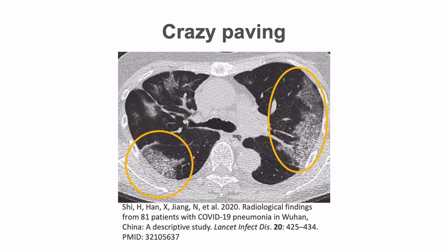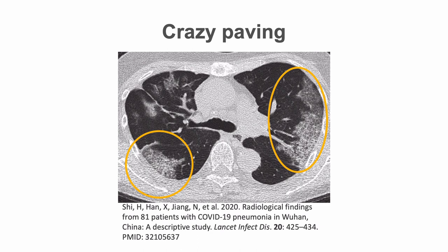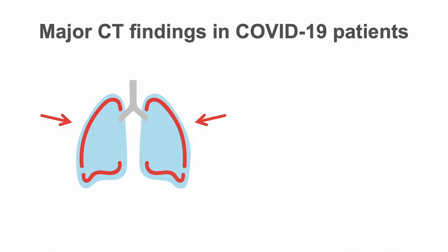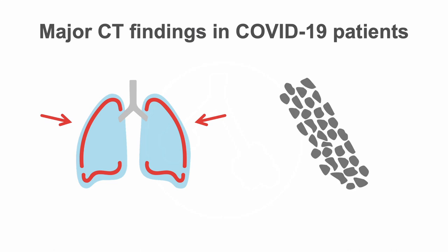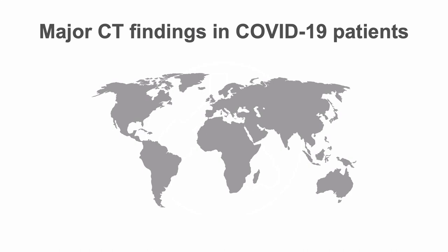This is a typical example of crazy paving appearance, where we see interlobular and intralobular septal thickening superimposed on a background of ground glass opacity in the subpleural lung zones bilaterally. To summarize, the predominant CT imaging findings of COVID-19 include peripheral, focal, or multifocal ground glass opacities affecting both lungs, with consolidations and crazy paving sometimes present later in the disease progression. The lesions often have a geographic distribution.